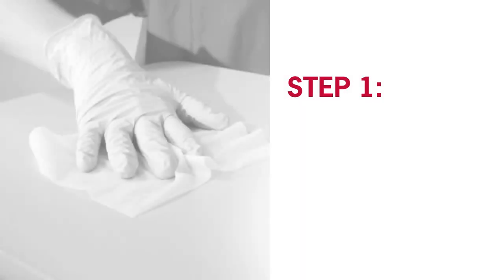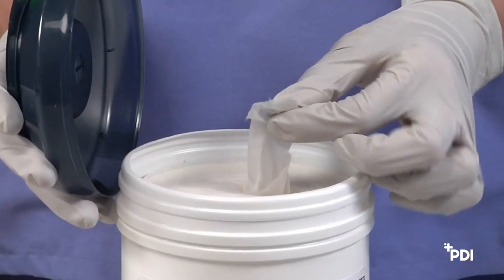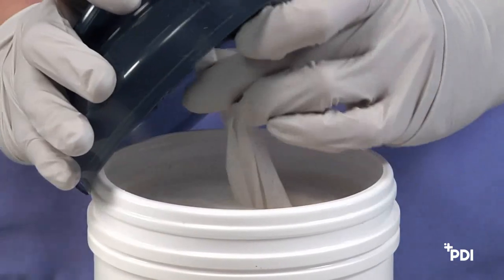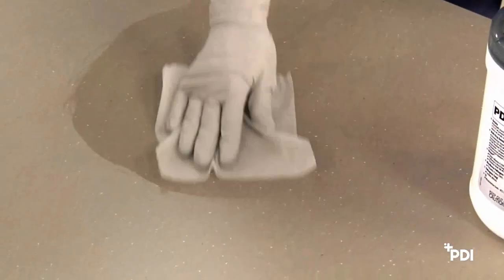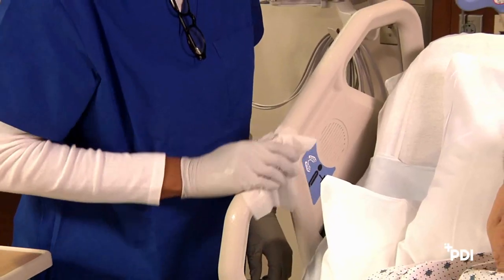Step 1: Prepare the canister. To prepare the canister to dispense the first wipe, find the center of the wipe roll, then twist the corner of the wipe into a point and thread through the hole in the canister lid. Next, pull through about 1 inch and replace the lid. There is no need to mix or measure. The pre-saturated wipes have the correct amount of germicidal solution, saving valuable time.